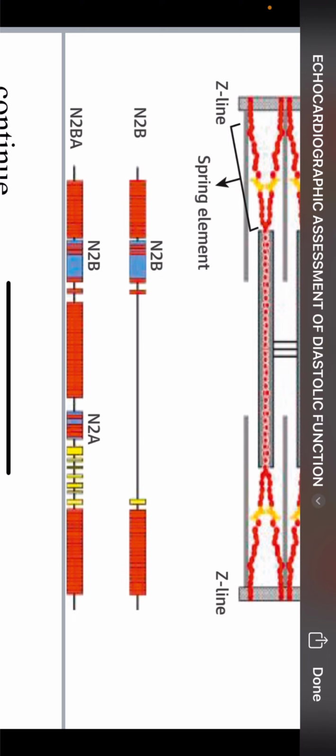A time which is less than 60 or less than 70, depending on the condition, means it is happening so fast, or it is just cut short before it finishes. That is also an indicator of diastolic dysfunction. So the normal range of isovolumic relaxation time is around 70 to 90. You have to find it somewhere there.